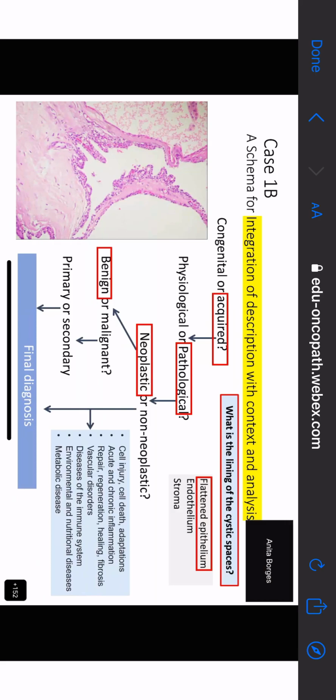What do you think this clearing actually is? So you have a cystic, benign neoplasm in the pancreas with clear cells lining the cysts. Yes, Suveta? Can be due to the thin mucin, ma'am. Due to thin mucin. Okay. Now let's ask Dia.